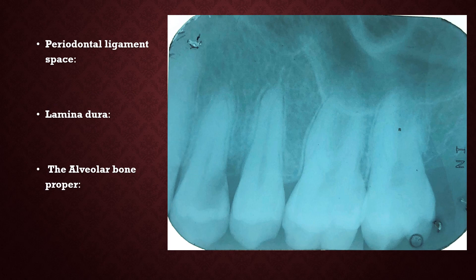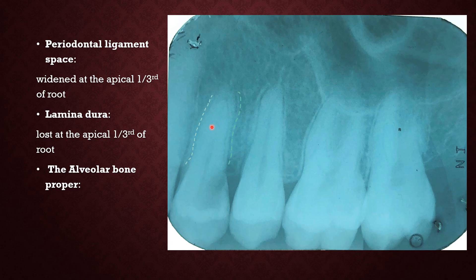Next, it is important to identify the periodontal ligament space. When looking at the PDL space, you can see a black line along the tooth demarcated by the yellow line. In this radiograph, at the apex of the tooth, you cannot see this yellow line anymore — this is the area where you have a widened periapical periodontal ligament space as well as a loss of lamina dura. The lamina dura is the white line and the PDL space is the black space between the white line and the cementum of the tooth root. The trabecular appearances seen are the normal pattern at the maxillary premolar apex region, and the alveolar bone proper appears relatively normal.